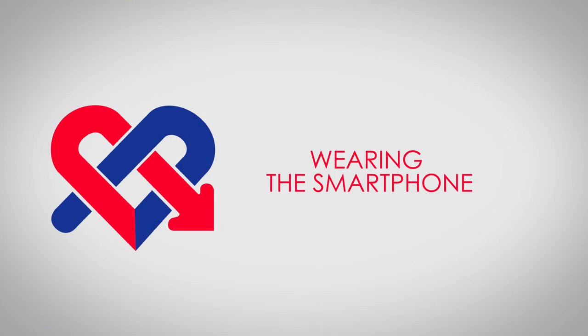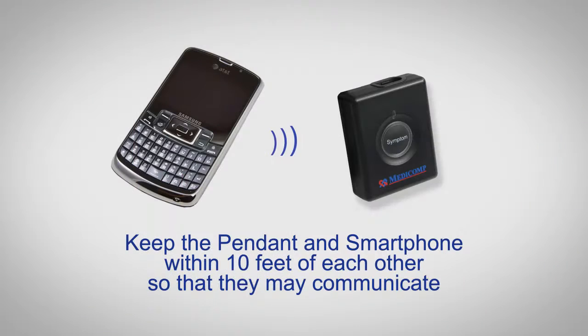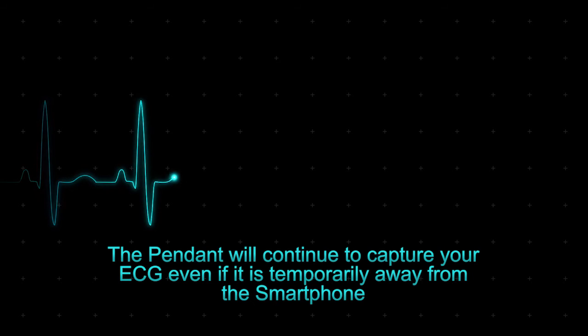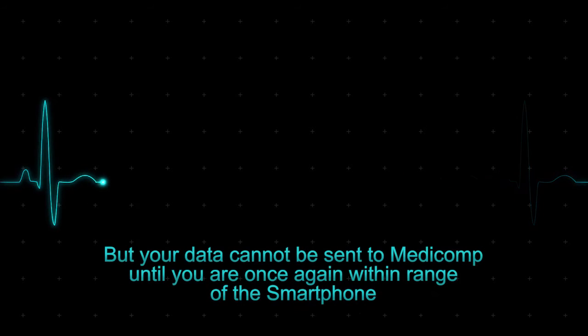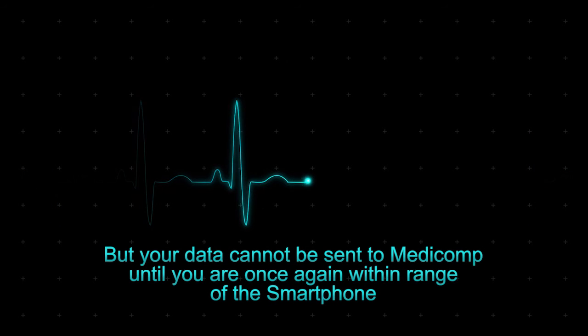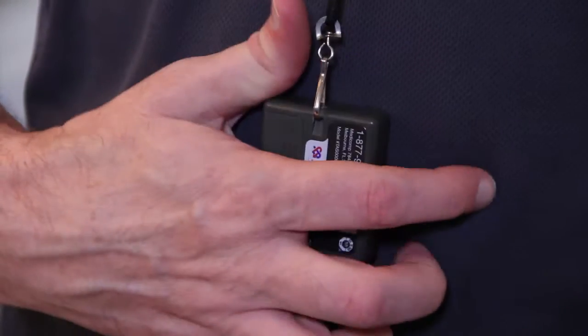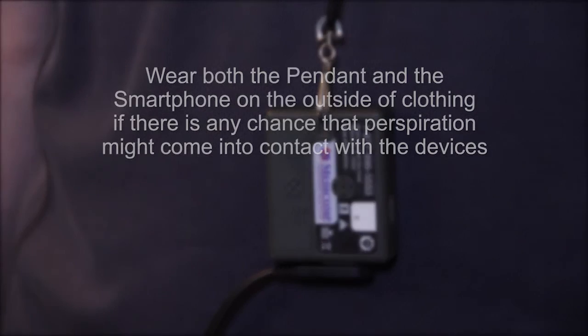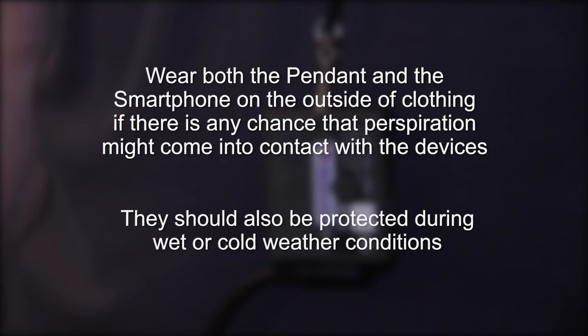Wearing the smartphone: It is not necessary to always keep the smartphone on your person, but as much as possible keep the pendant and smartphone within 10 feet of each other so that they may communicate. The pendant will continue to capture your ECG even if it's temporarily away from the smartphone, but your data cannot be sent to MEDICOMP until you are once again within range. Both the pendant and the smartphone should be worn outside your clothing if there is any chance that perspiration may come in contact with the devices. They should also be protected during wet or cold weather conditions.